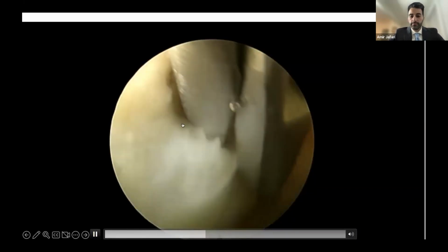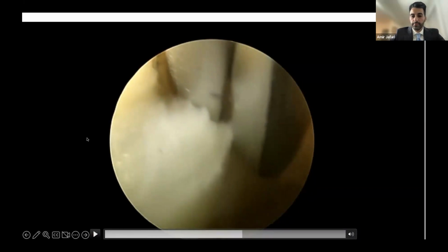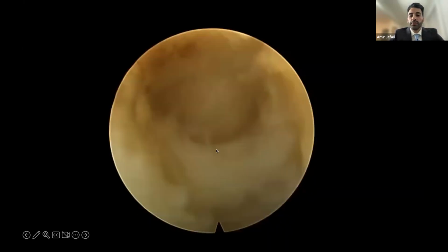Again, once you break that ligament, you create the hole, you see epidural fat. What we do in this portion of the surgery is increase our irrigation pressure. So once the hole is made, the fluid will fly in there and push the dura away. That will create a gap between the dura, that's most likely sitting behind this fat, and this ligament. This space is very important because then we can put our instrument between this fat and this ligament and just start cutting away this ligament.